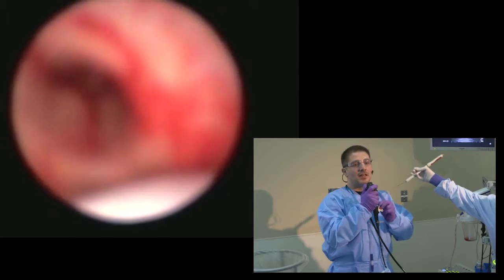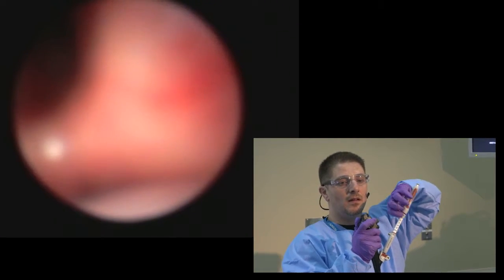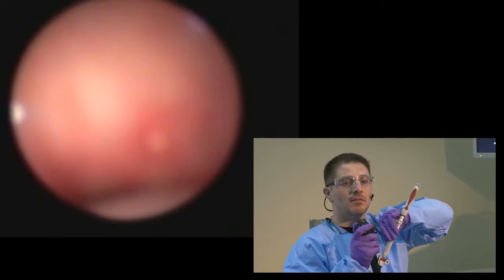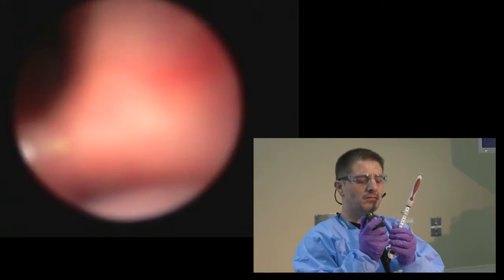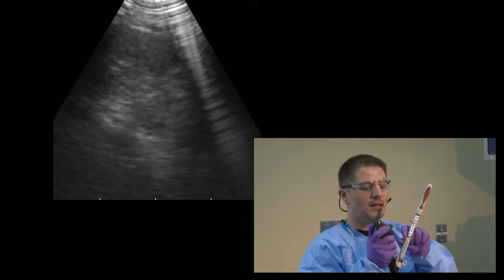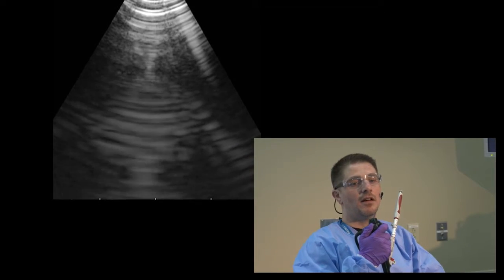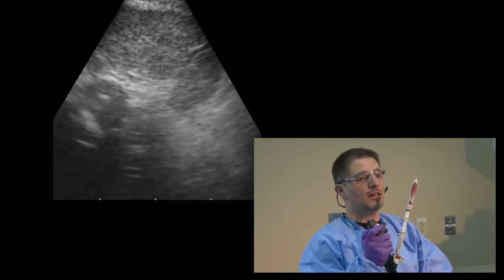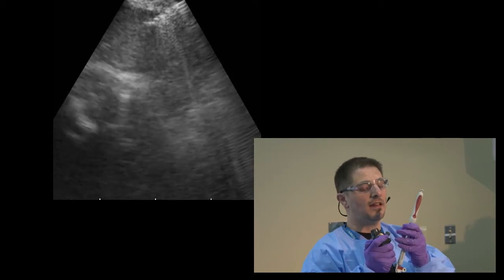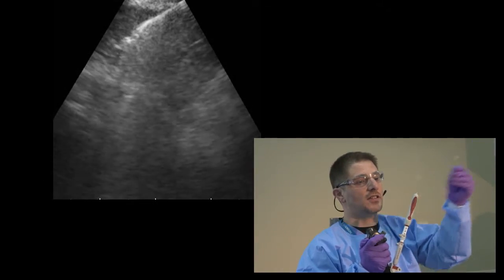Now we collect samples for cell block from station 7, the subcarinal lymph node. We're going to do suction with it for cell block. We set up our needle and our sheath. You identify the sheath on the endobronchial view. Now you identify the carina, and you go down, you find your lymph node, and you pass the needle in. You can have more depth if you need to. The stylet will be out, and we'll use suction for this one.